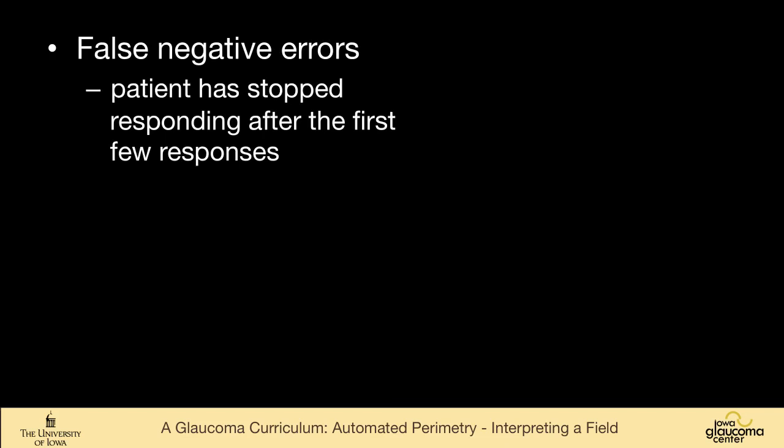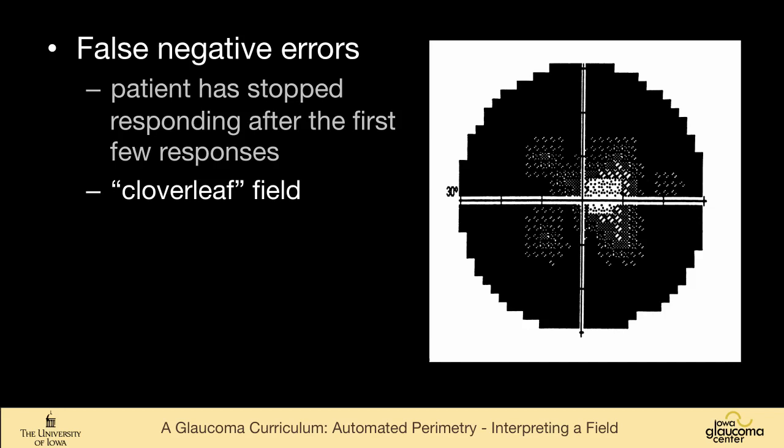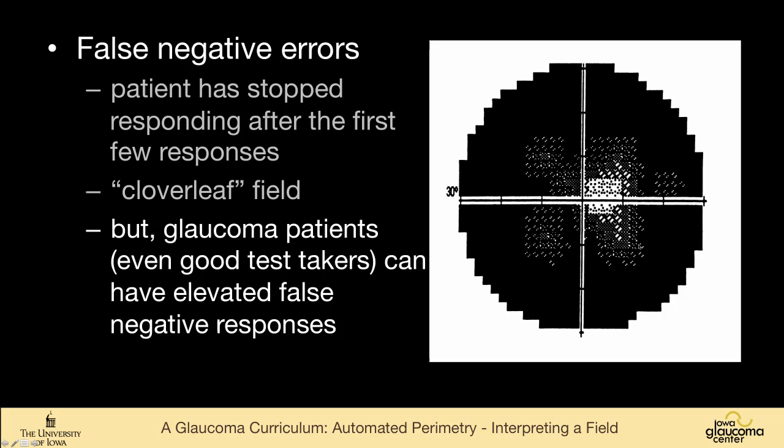False negative errors, and this person, 0% false negatives, is when the machine maps the first few spots, and then goes back and sends a bright light, brighter than what was thresholded into that spot, and the patient doesn't respond. So you often get what's called a cloverleaf field. You can see that the patient has responded to a few of these test points, and then basically has stopped participating in the field.